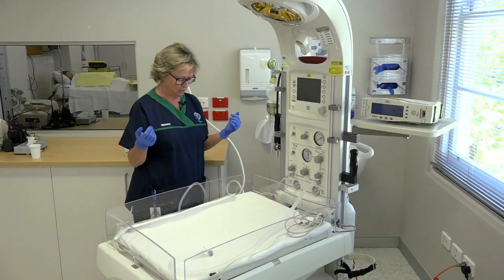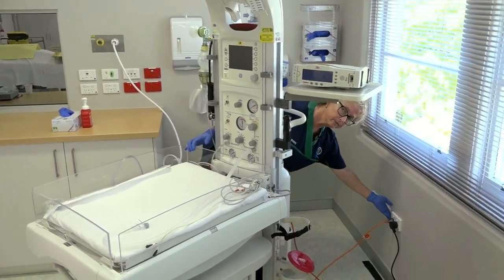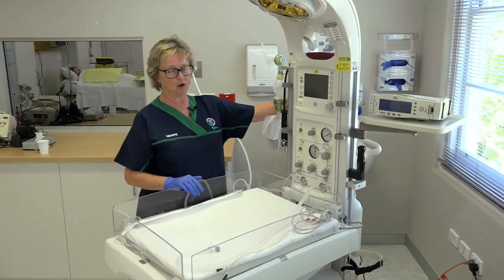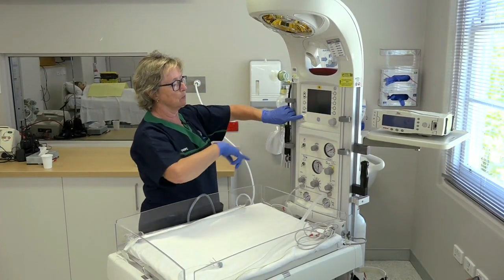In continuation of our preparation for resuscitation, we need to make sure our equipment is on. We turn it on at the wall. A second switch is at the back of the cot just here, and our third switch controls the onboard computer.